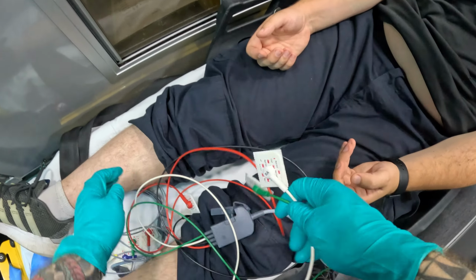So now once you apply the leads, you could put the shirt down, or the patient has a gown. You want to check the patient's age. Usually it's printed on their armband, or ask him, sir, how old are you? I know he's 28 years old, but I will check the armband. The reason I need the age is for the algorithm. So now, once all my leads are connected, I'm going to tell the patient, sir, please don't move.